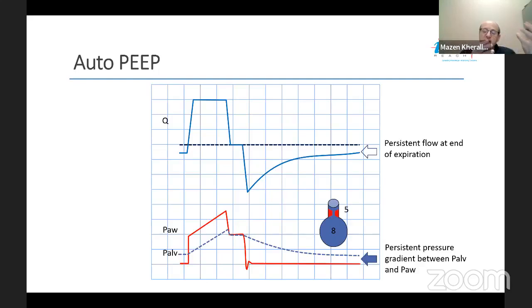Whether this patient is volume control or pressure control, it doesn't make any difference actually. Adding external PEEP is not going to make any difference in terms of ventilation in patient who is not spontaneously ventilating. Adding external PEEP is going to benefit only if the patient is spontaneously breathing.